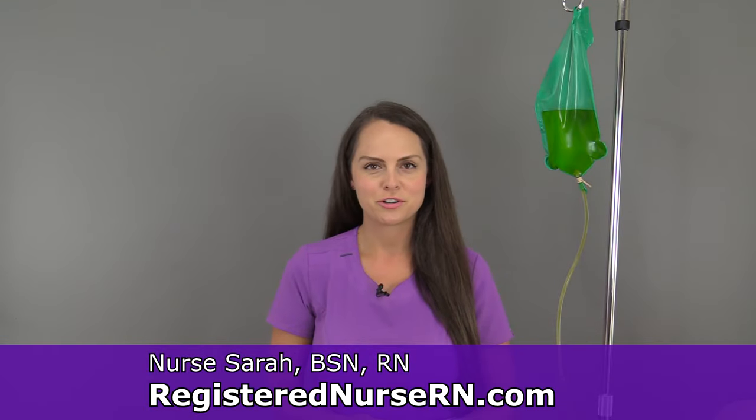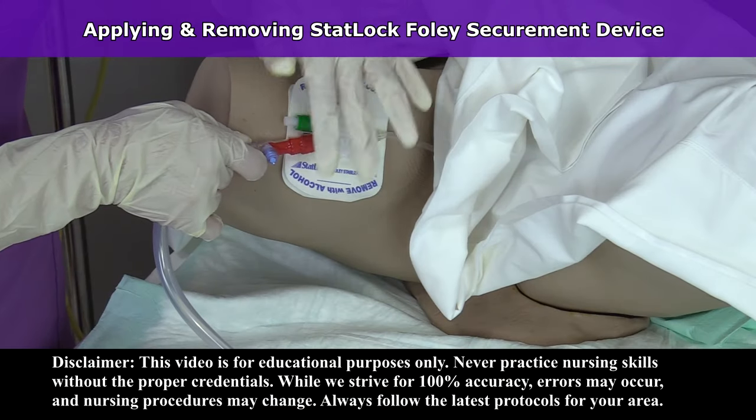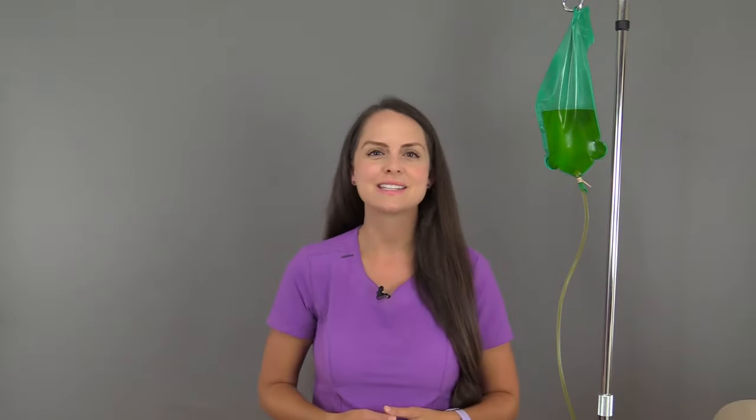Hey everyone, it's Nurse Sarah with RegisterNurseRN.com and in this video I'm going to demonstrate how to apply and remove the STATLOK securement device for patients with an indwelling Foley catheter. So let's get started.